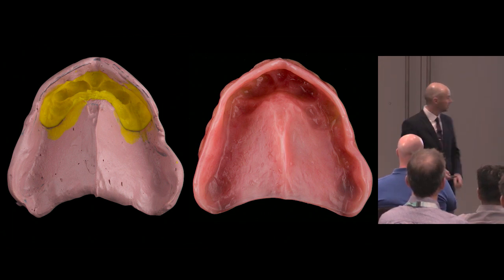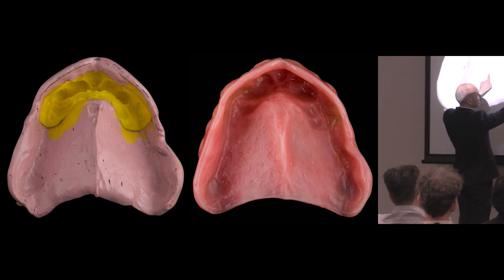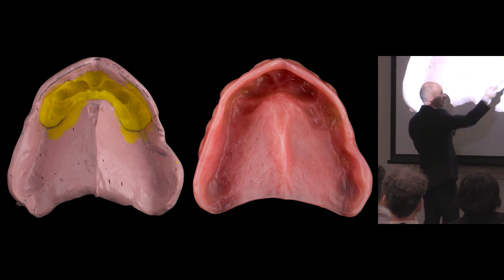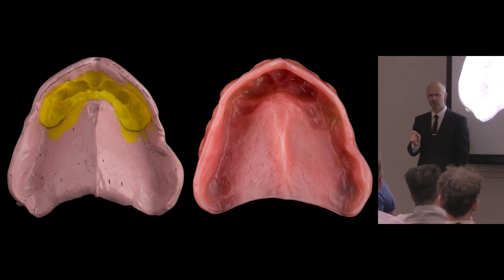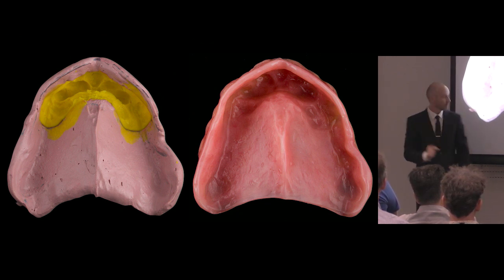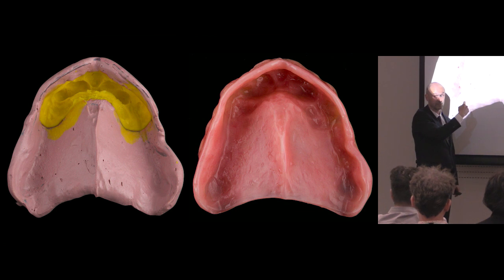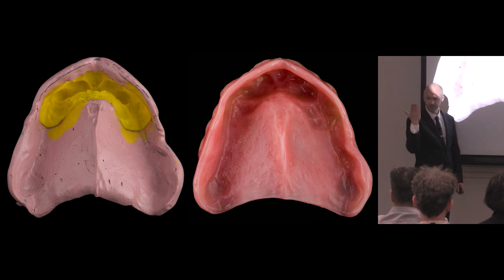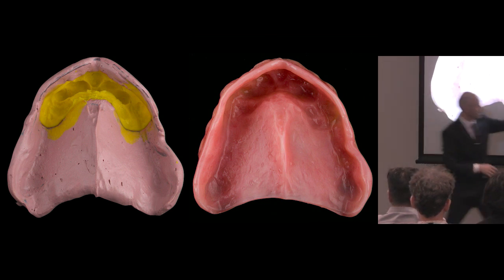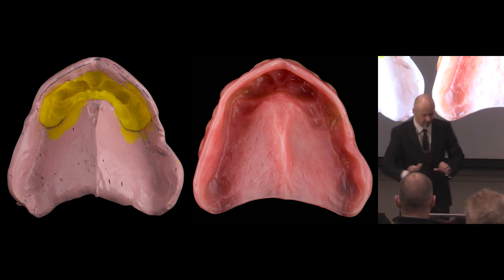In fact, I don't even... The primary support area for that is here. It's a good question. But seriously, I wouldn't even think about it. The most important part is that I've got a great periphery for suction. It's all about this. I don't actually care too much about that centre bit, because it's the periphery that forms the suction. And then if I came to fit the denture, so say we've got the denture here, I try it in. So we digress, but it's a really important point.